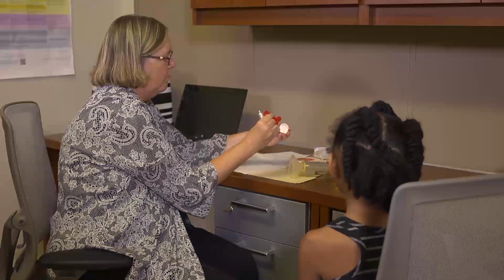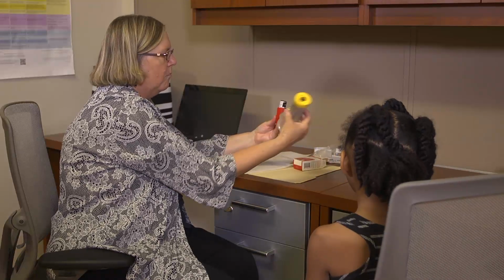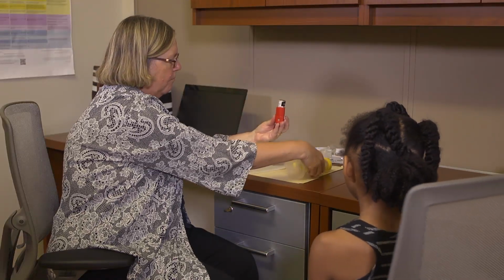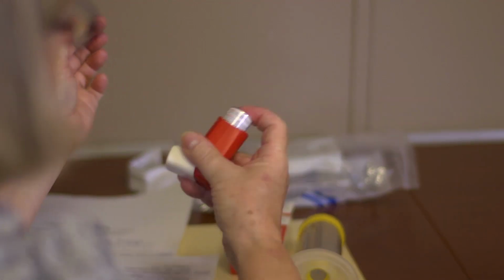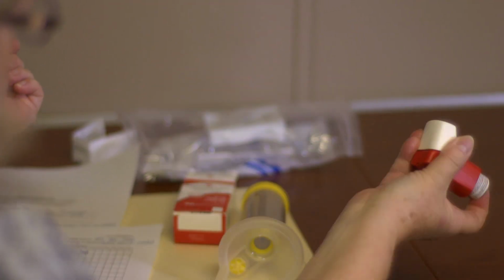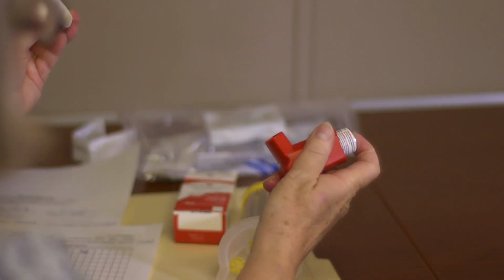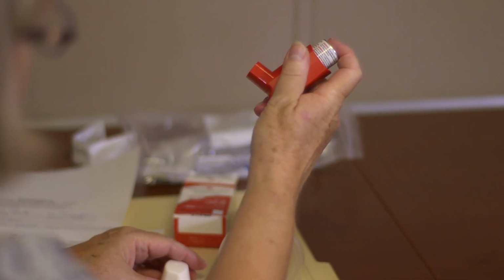Make sure the inhaler and spacer are free of foreign objects. Shake the inhaler for 5 seconds to mix the medicine. Remove the cap from the mouthpiece. Prime the inhaler if indicated.